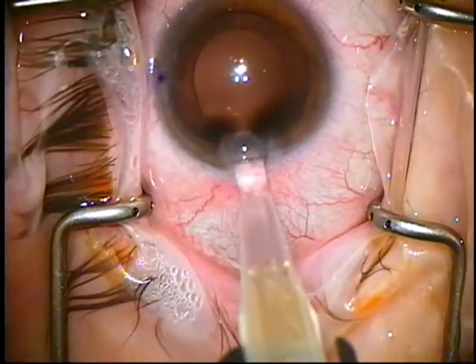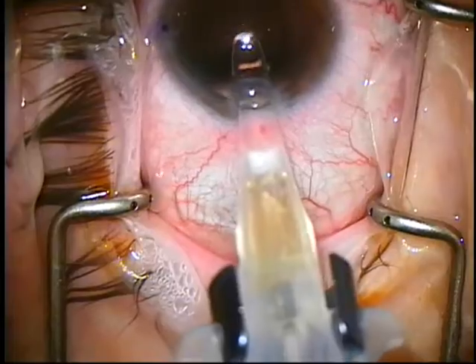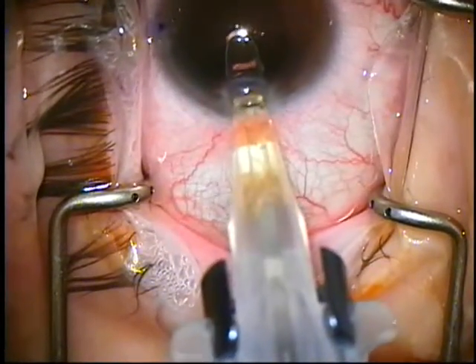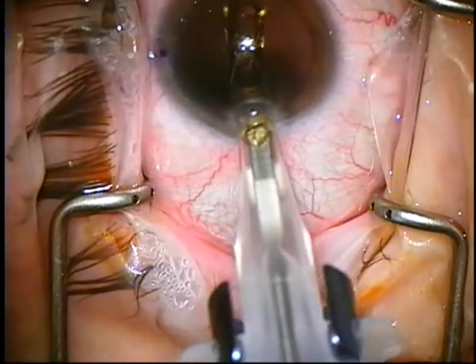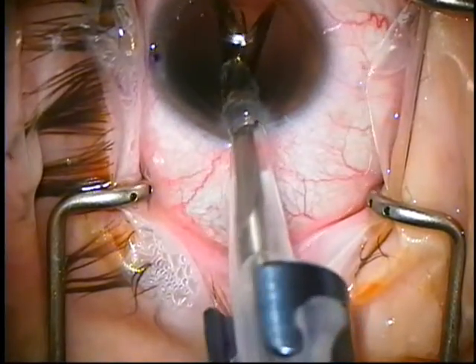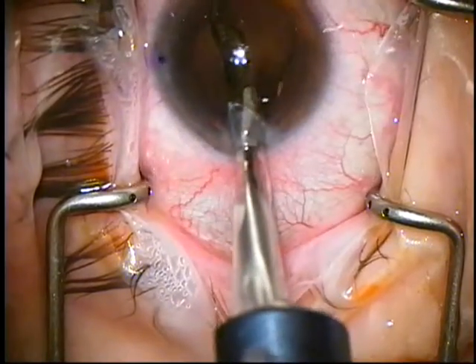This is a D cartridge. It enters in my 2.75 wound. I go dead center — that's as far as I can go. I engage my screw mechanism, and I hold it with my dominant hand, screw with my left — my non-dominant — and I'm tilting to the left, making sure the lens centers nicely and doesn't tilt upside down on me.